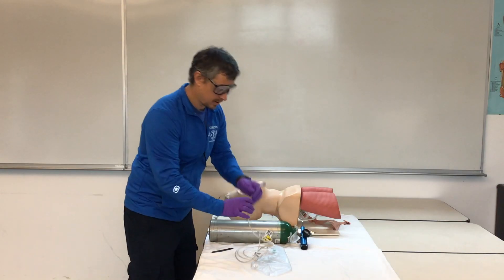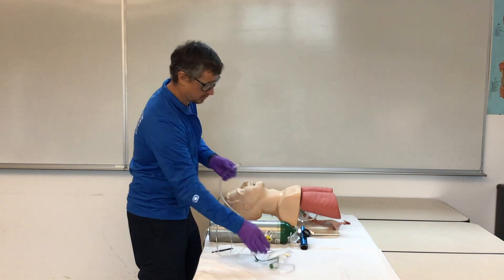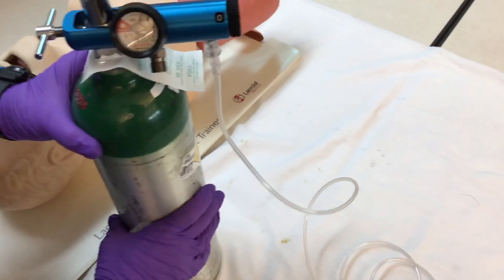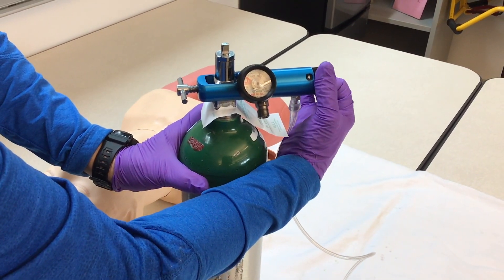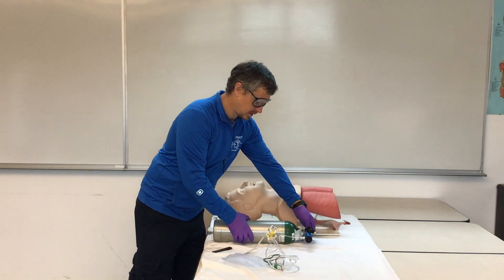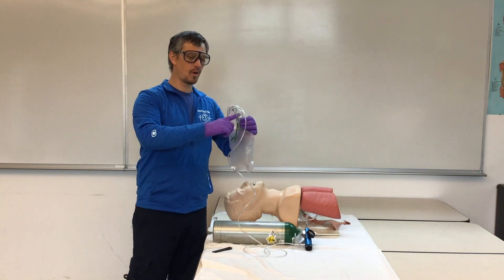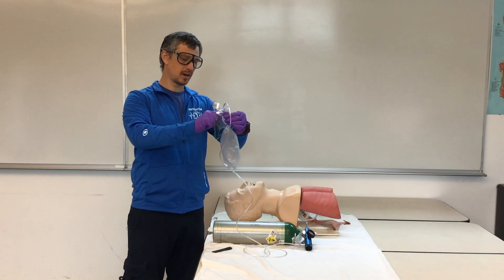Set our tank down and grab our administration device — this is going to be our non-rebreather mask. Plug it into the regulator and we're going to turn our flow rate to 15 liters per minute. We have a range of 10 to 15, depending on what our patient requires. Make sure that you set your tank down rather than have it stand up. We're going to put our finger over the one-way valve to pre-fill our reservoir, and we'll see our bag start to fill.